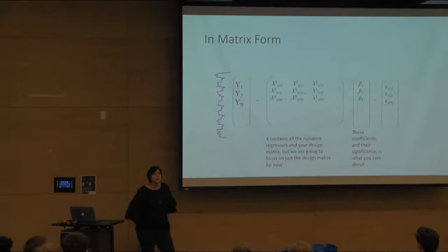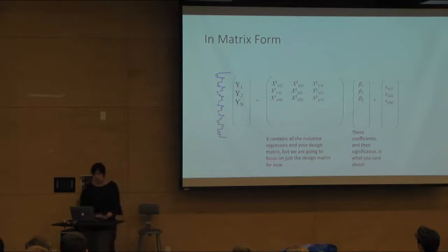It's in contrast to a lot of behavioral types of designs where you think about modeling behavior, and if you only explain 10% of the variance in what you're trying to explain, that would be ridiculous, right? Psychologists would have a fit, they would reject it from the journals, all would be over, right? But this is normal for fMRI design, that you explain only a very small amount of the variance. We just do things differently in fMRI. We often don't look at that. Some tools make it easier to do so than others.